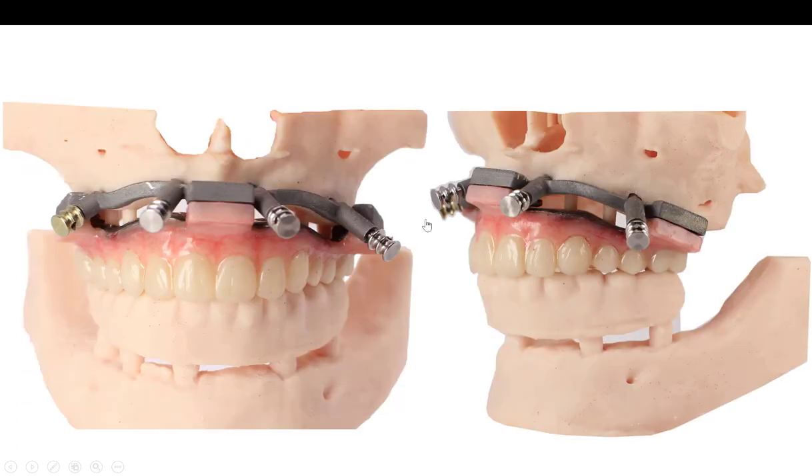So this is the final result. We've got the hybrid in occlusion indexed off of the reduction guide. Once that gets picked up, all you have to do is fill in the little gaps that are going to be between your cylinder on the intaglio and the temp. Then there's really not going to be anything to polish — you just want to remove any excess composite material off of that metal framework so that you've already got that highly polished surface. That's it.